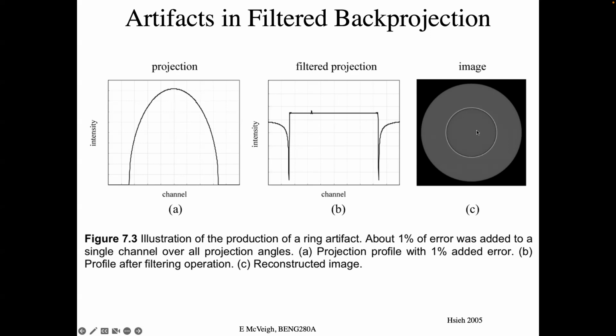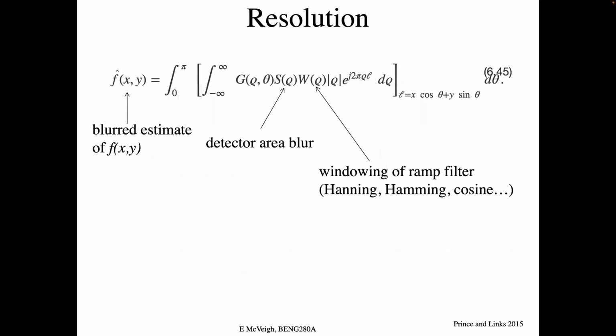So if you see these ring artifacts in, say, your dad's or your mom's CT, they either did a really low dose scan or it was a really poor scanner, so you have to work that out for yourself. But normally, if a detector goes bad, it's detected by the scanner itself in its calibrating step, and it'll call the GE tech to come out.